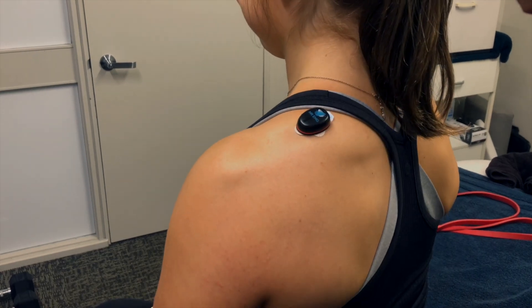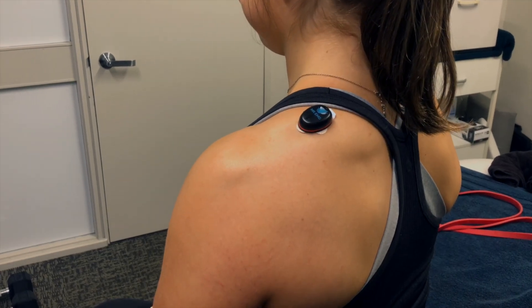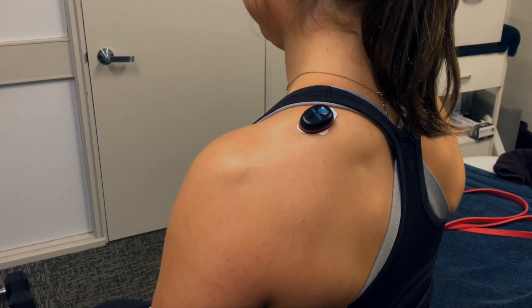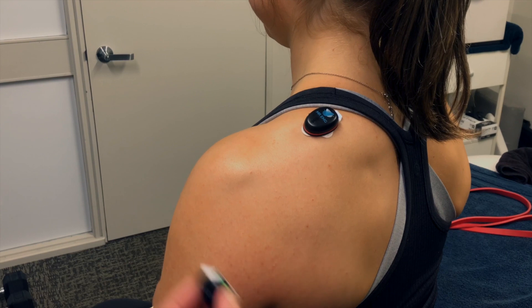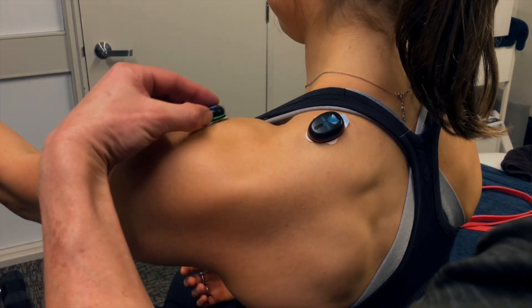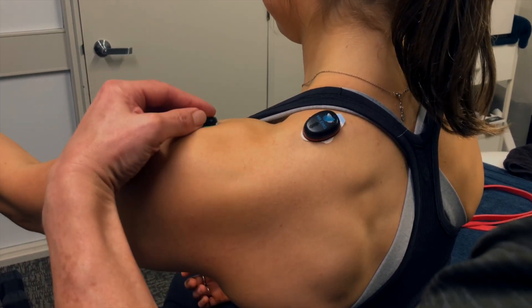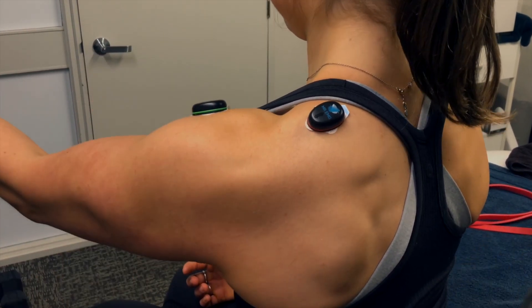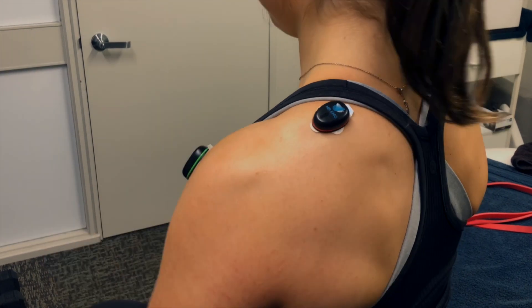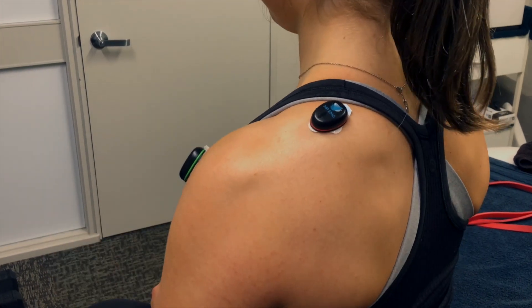There is an easy clinical test for the shoulder when assessing musculoskeletal pain symptoms, including loss of mobility, adhesive capsulitis, rotator cuff injuries, and non-specific ongoing shoulder pain.